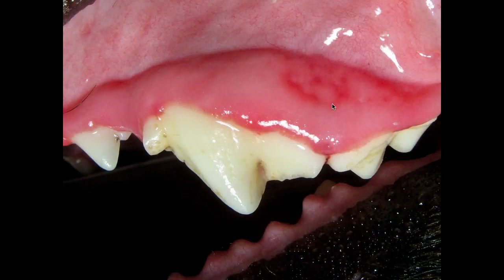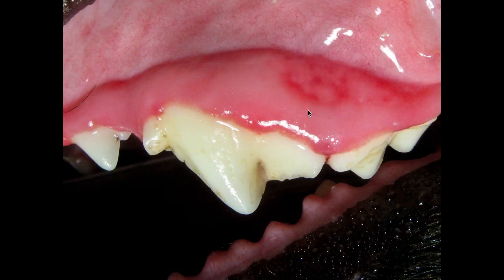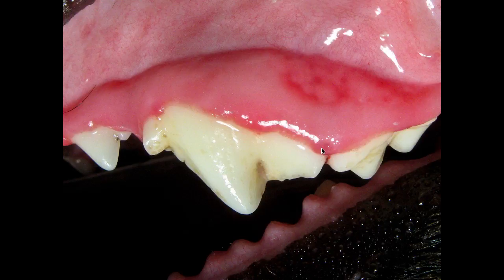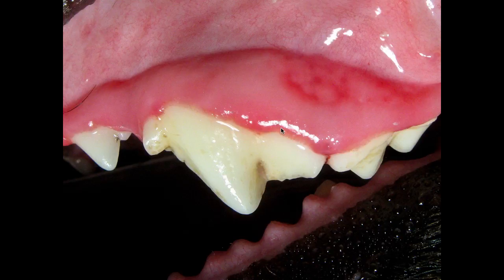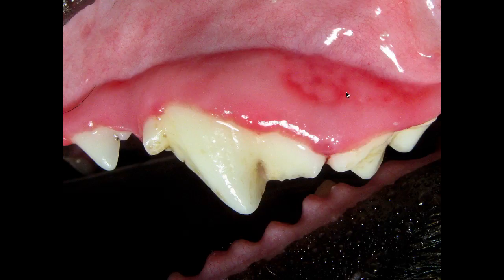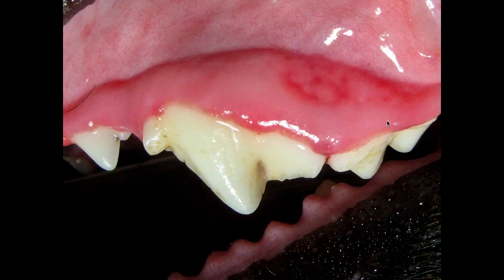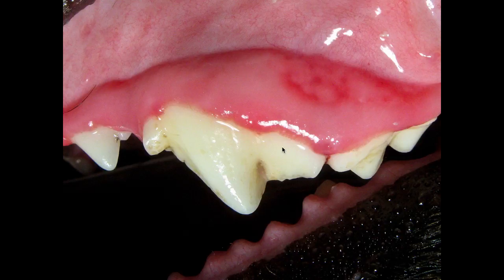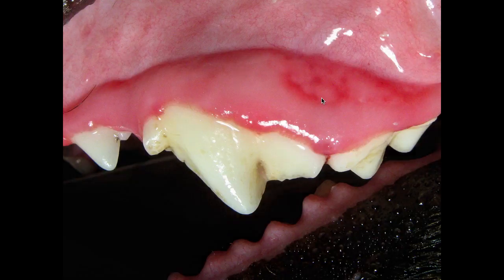If you see a defect like this where there's erythema but you take a periodontal probe in and don't get any probing depth, there's something causing that. Generally what you're going to find when you open that tissue is that there's bone loss here.